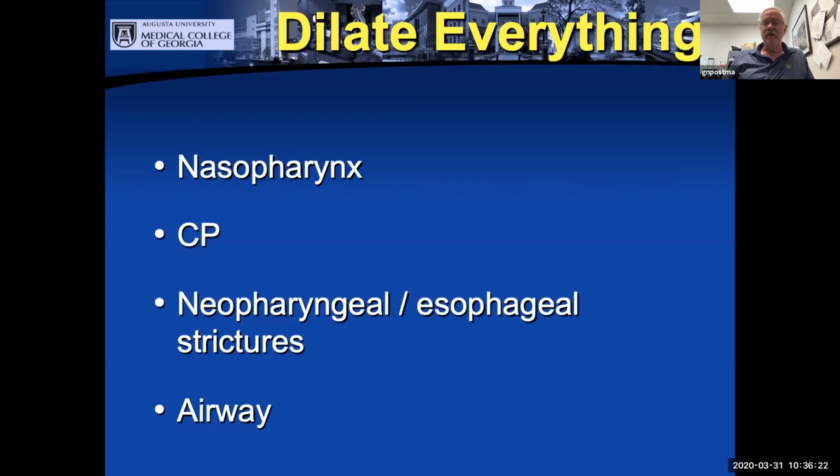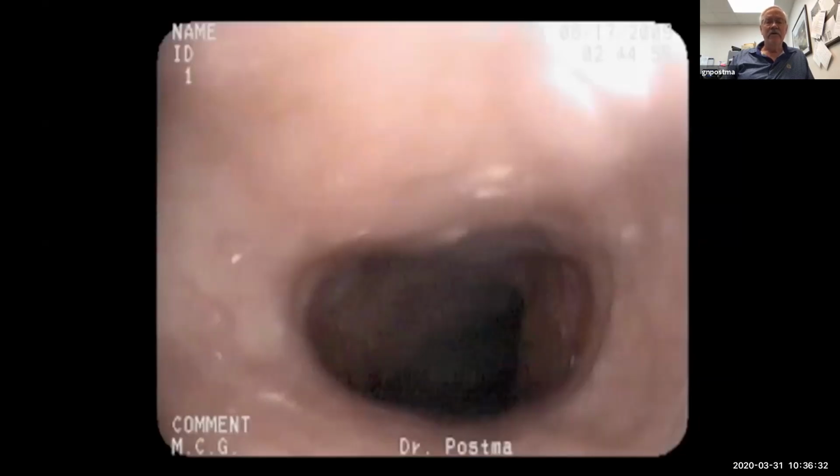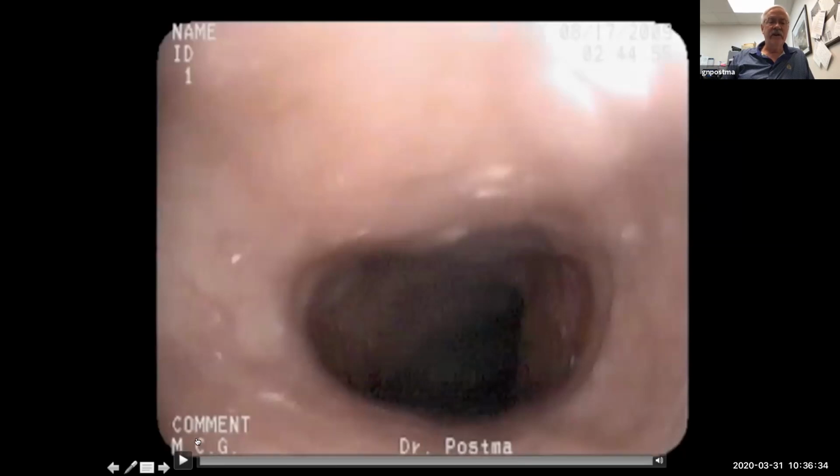We stopped doing that. People tolerate it okay, but we have such good anesthesia and such quick turnover that we do most of those now in the OR. So, a couple of videos, kind of the routine stuff.